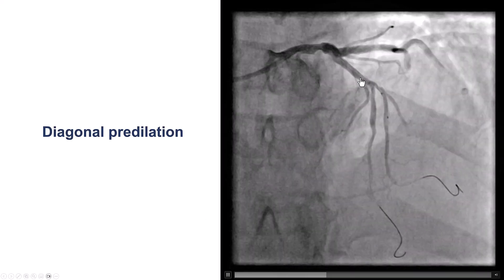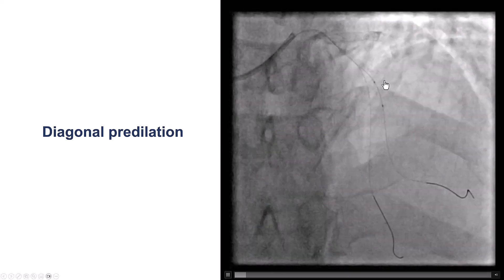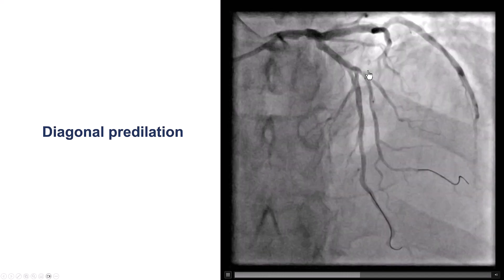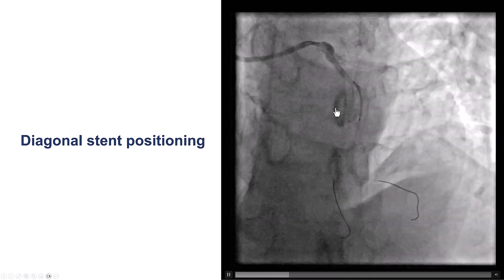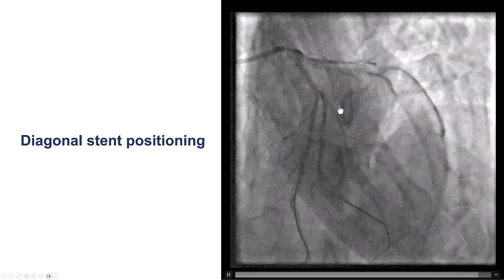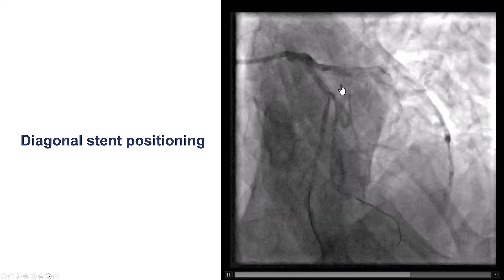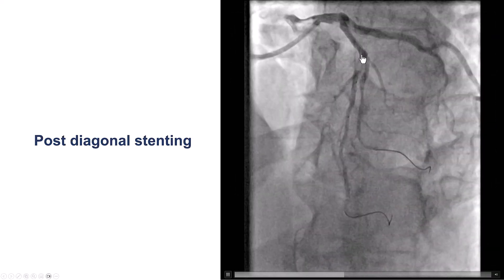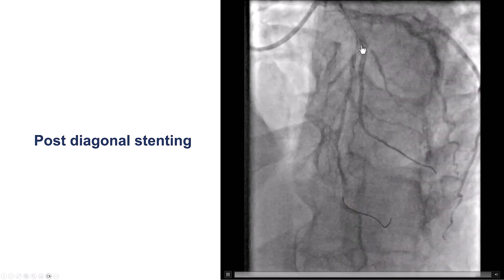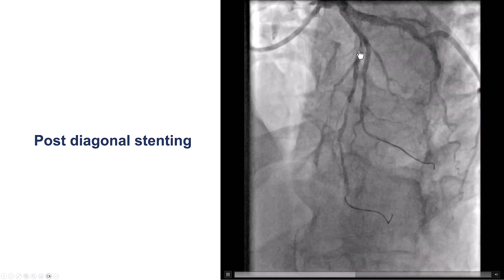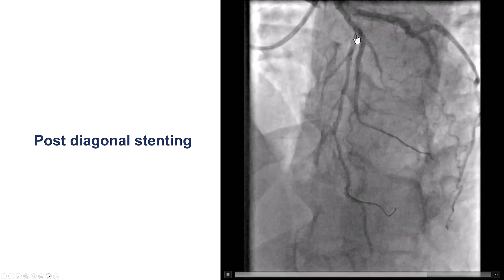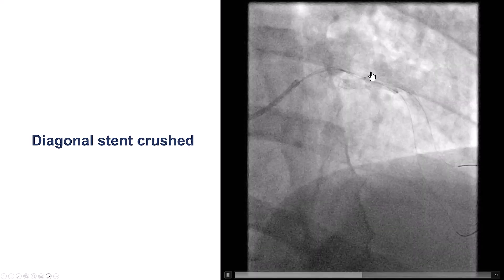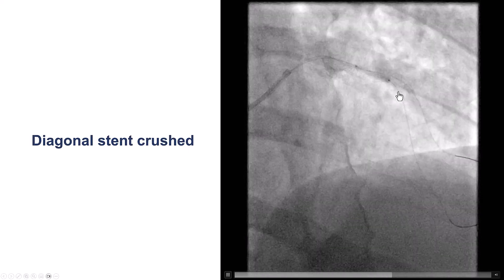The plan was to do PCI of the LAD-diagonal bifurcation using the DK-crush technique. We predilated the diagonal, and then we placed the balloon into the LAD and the stent into the diagonal, having a slight protrusion of the diagonal stent into the LAD. The stent was deployed in the diagonal, and what happened is a carina shift. We now have a significant lesion visible in the LAD.